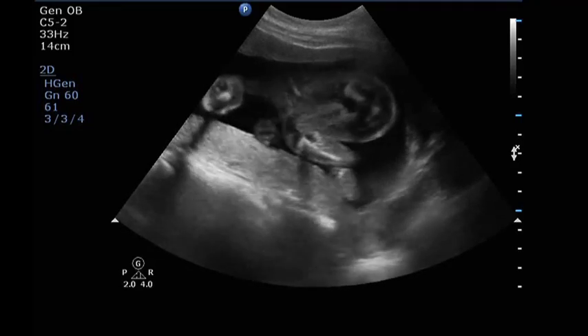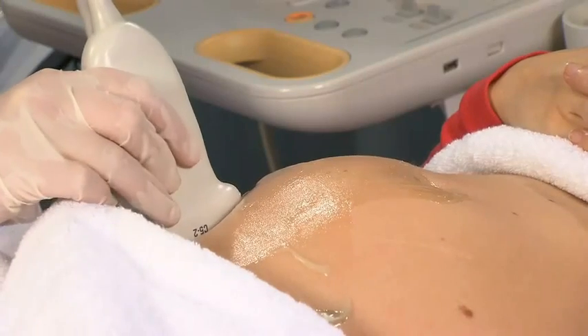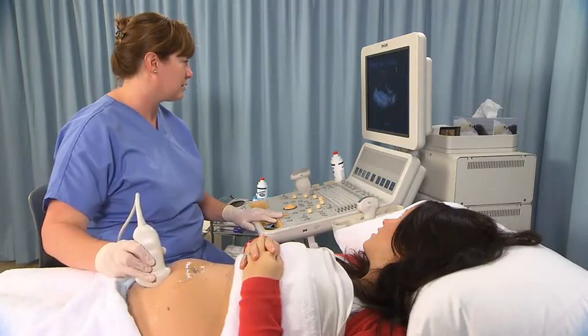The second trimester ultrasound examination is a routine anatomy examination commonly performed between 18 and 22 weeks gestation.